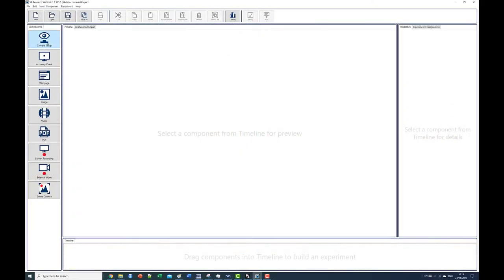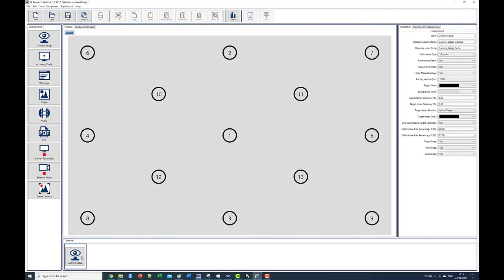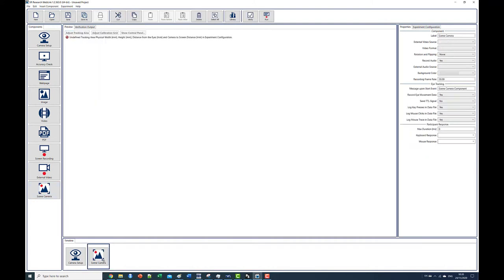Let's create a Weblink project. First we add a camera setup component to the timeline. We can leave the settings at their defaults for now. Next we add a scene camera component.